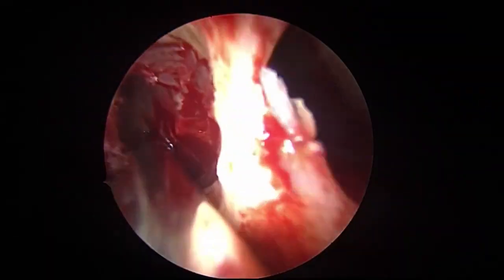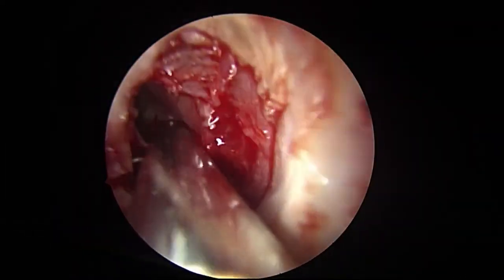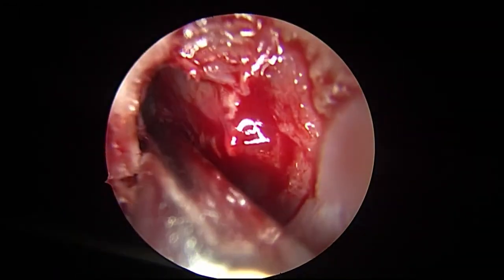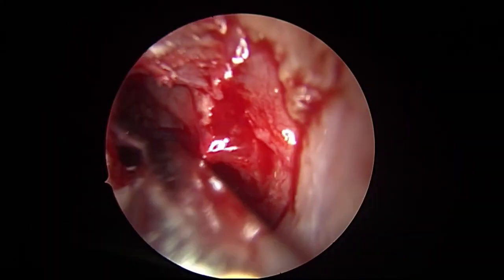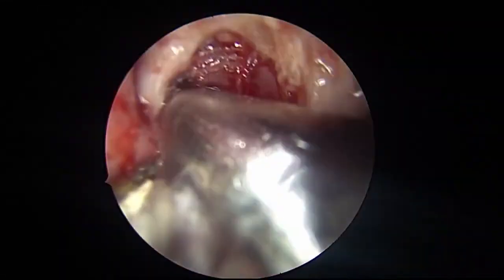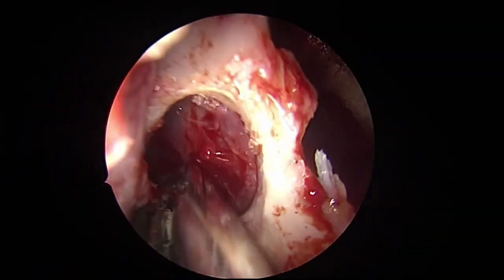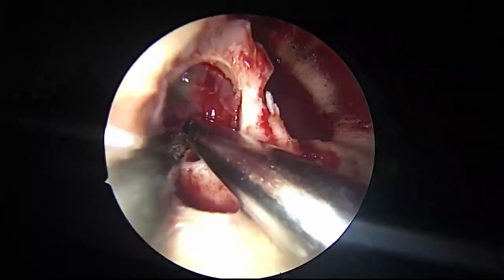See, this is inside the maxillary sinus. Can you see here? Yes, sir. And see, this is the lateral bulge of the medial wall of the maxilla. Can you see this entire medial wall pushed laterally? Yes, sir. If you remember the CT scan, if you remember how this anterior component has pushed the lateral wall. Okay?